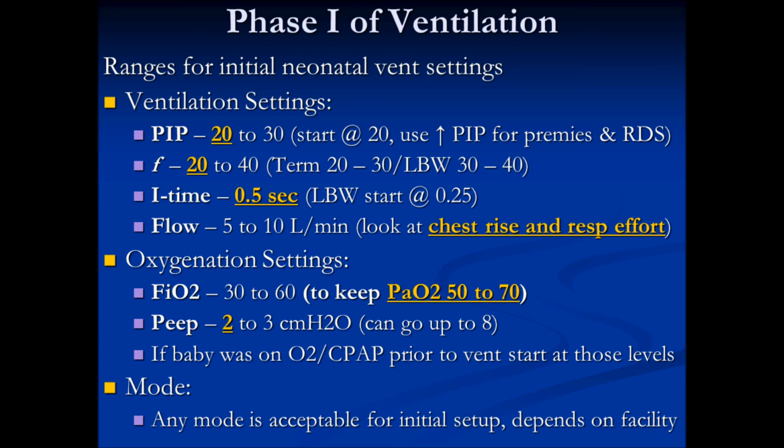Lastly, for the NBRC, mode doesn't matter. Even with neonates, mode doesn't matter. Any mode is acceptable for initial setup. And clinically, it depends on your facility. What does your facility typically use? That will drive what mode you will use when you set them up on the vent.